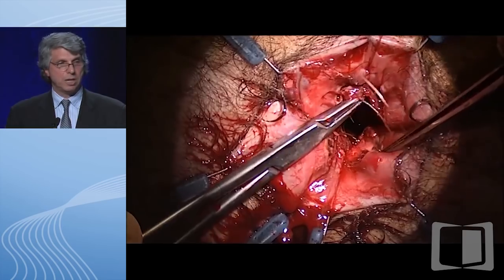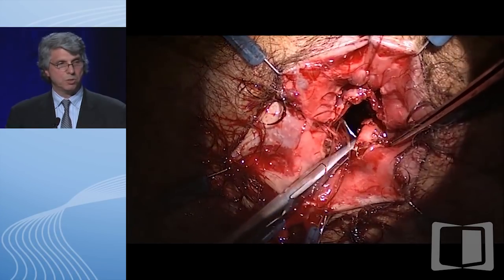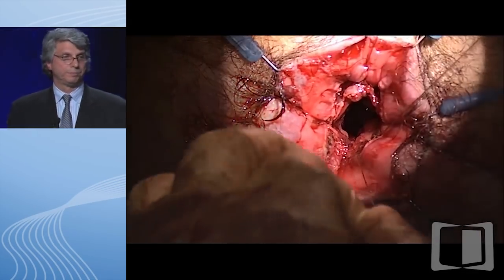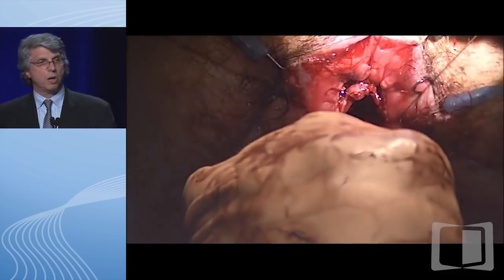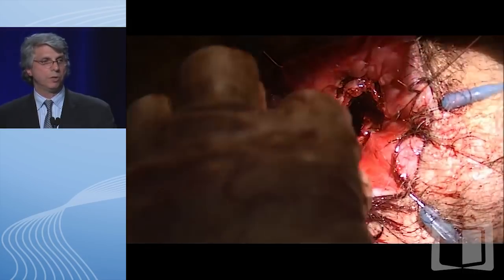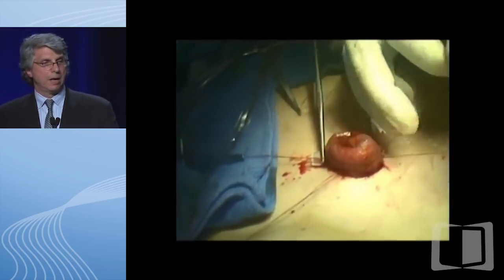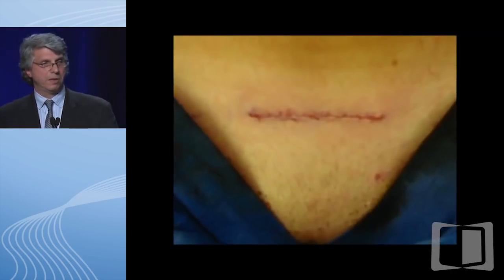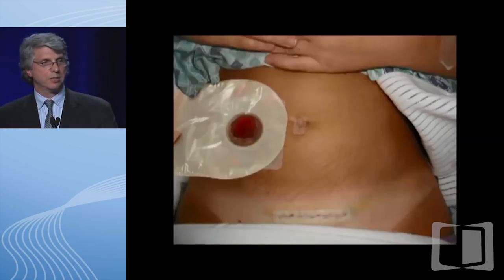This is the stitch now onto the anal side—it takes a little bit of the muscle and a little bit of the mucosa. The ileo-pouch anal anastomosis, hand-sewn, has now been created. In almost all cases now, you actually divert these patients with a diverting loop ileostomy. The ileostomy is shown being created here. That's the way the incision looks when it's done. There's an ileostomy. Thank you for your time.